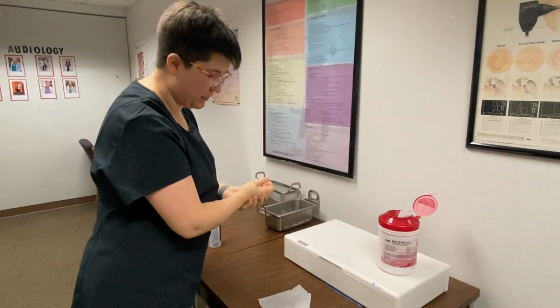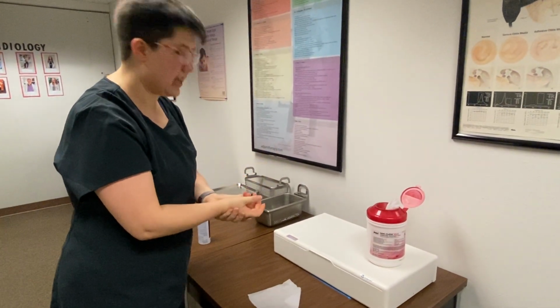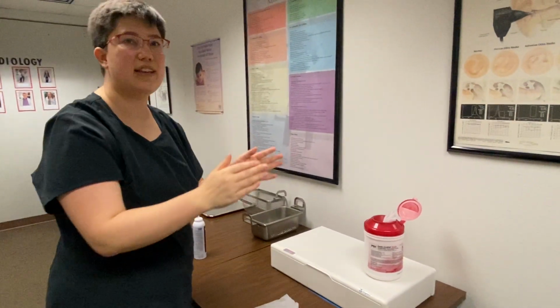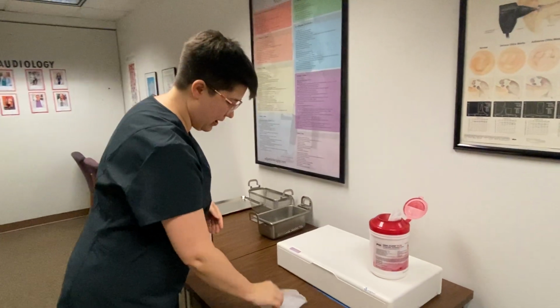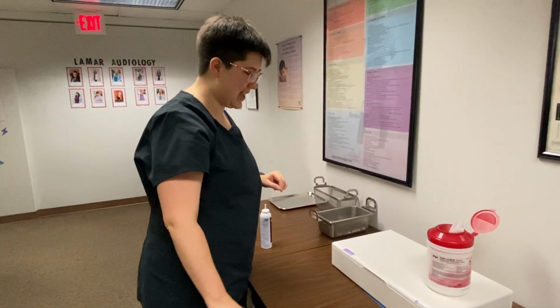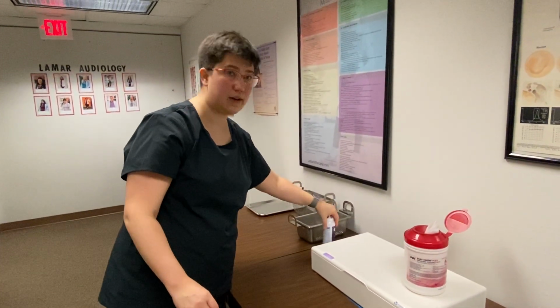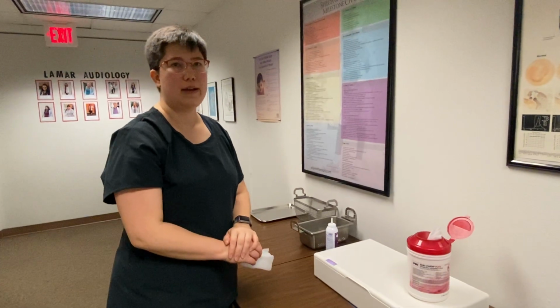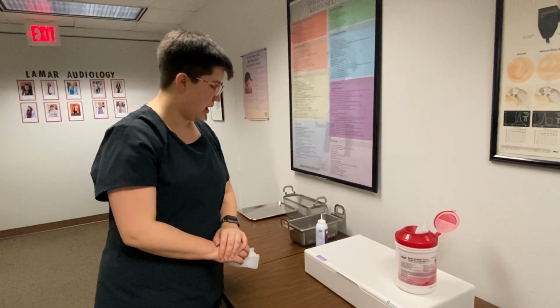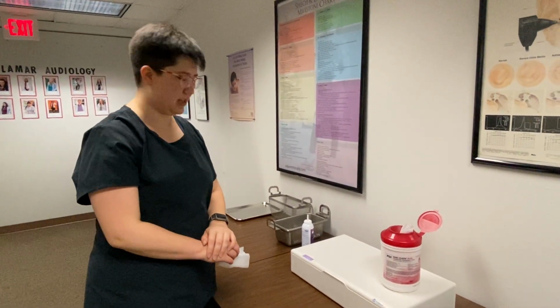Dr. Burns, when we close this, is it automatically going to deep cleaning? It is automatically going to run that cycle. It's going to do quick clean, then deep clean. Perfect. And it works better if you have a trash can. So we'll get that situated. So that's what you're going to do to sterilize your mask. About how long is the deep clean? It's 30 seconds for the quick clean, another 90 seconds for the deep clean.